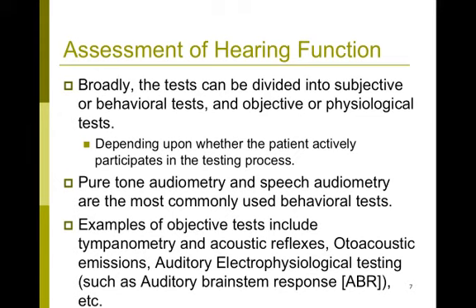We had hinted at this earlier when we talked about tympanometry, but broadly, the tests that we use can be divided into subjective or behavioral tests and objective or physiological tests. This categorization depends upon how much participation is required from the patient. In Puretone audiometry and speech audiometry, the patients are required to actively participate by letting us know that they heard tones or repeating words or sentences for us, as is the case for speech audiometry.